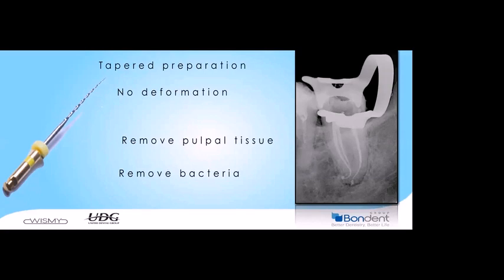What is the objective of the cleaning and shaping? When we perform the cleaning and shaping, we have mechanical objectives and biological objectives. The mechanical objectives are carried out using the files. And what are the mechanical objectives? The mechanical objectives are to get a taper preparation.